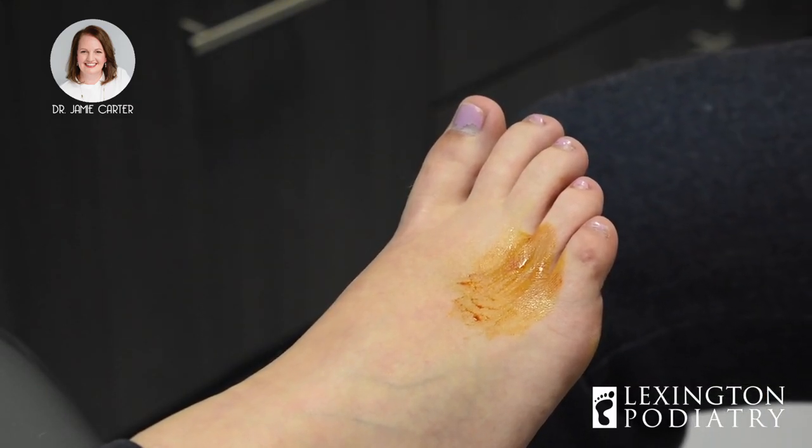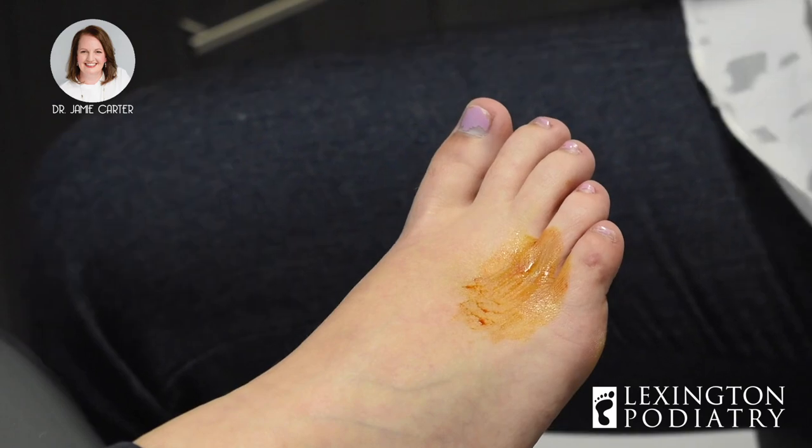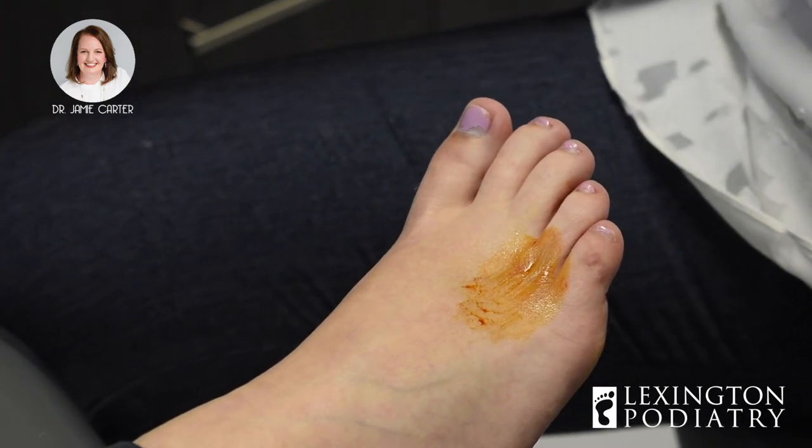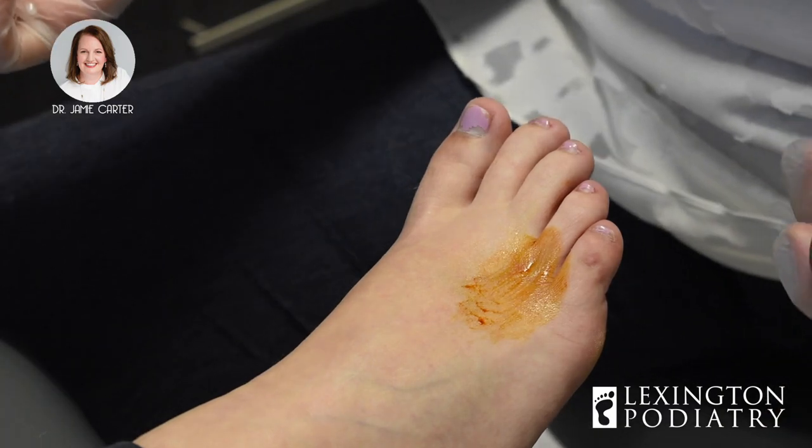This is a mixture of Kenalog, which is a steroid we use, as well as lidocaine and marcaine for numbing purposes. We also spray the area with a cold spray — it helps to freeze the skin so you don't feel the initial poke of the needle as much.